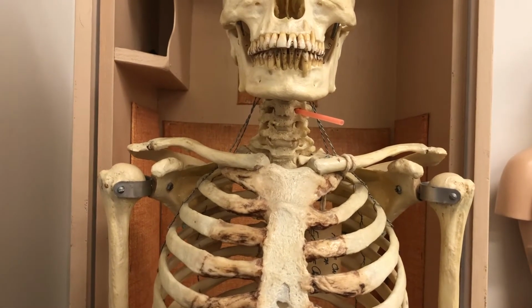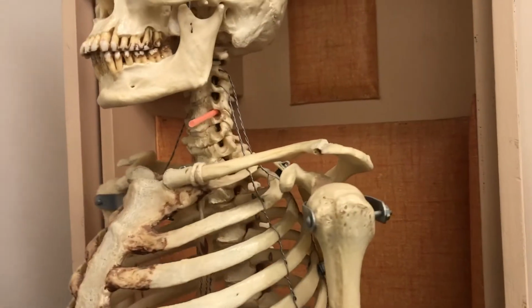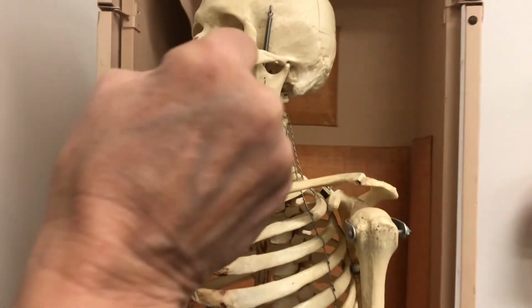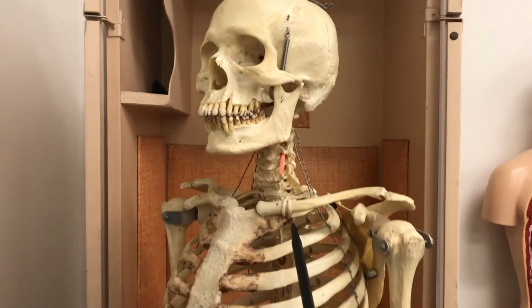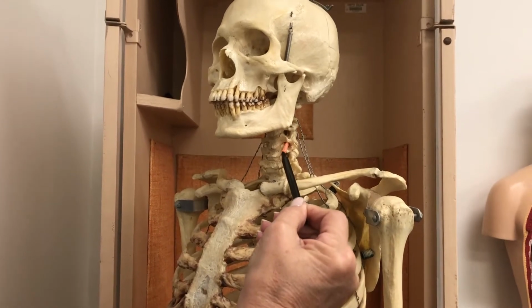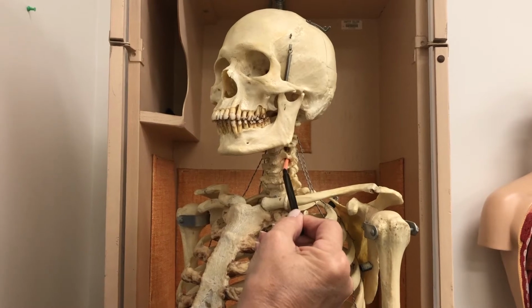So if I was going to see through this hole, I would have to oblique the patient 45 degrees, and I'd have to take my central ray and angle 15 degrees cephalad. And now my central ray will pass directly through the intervertebral foramina.